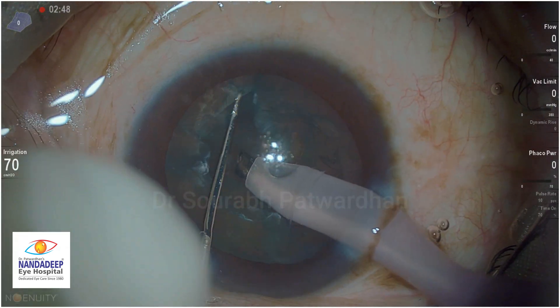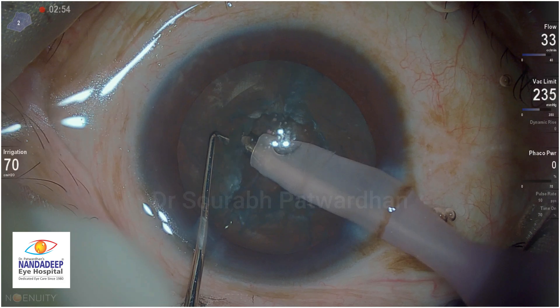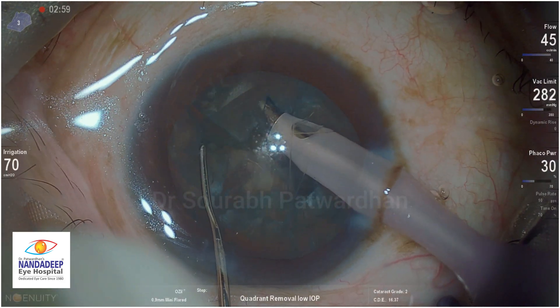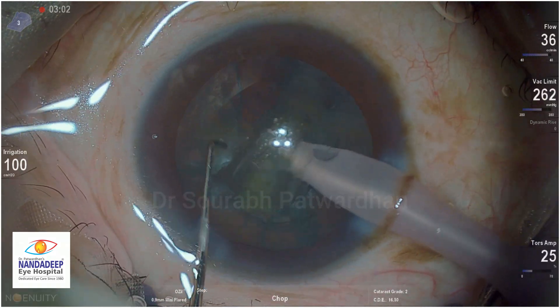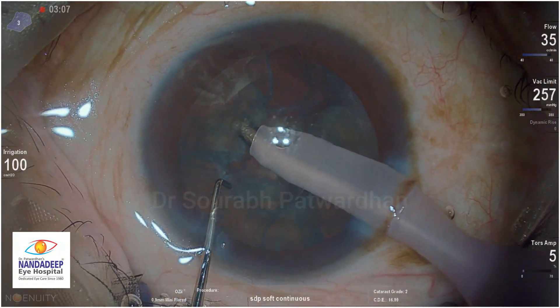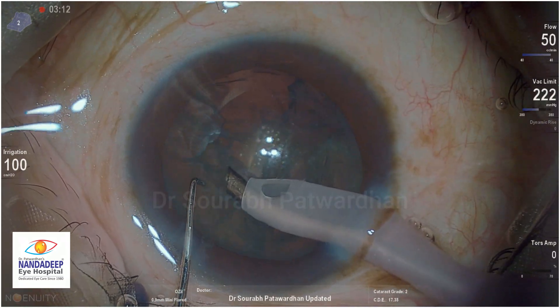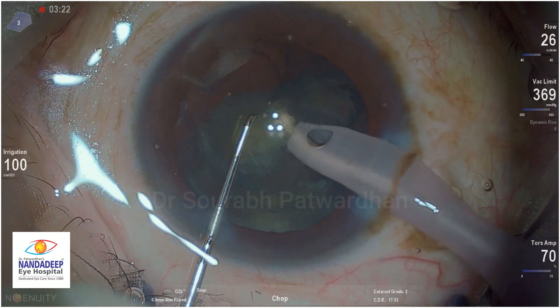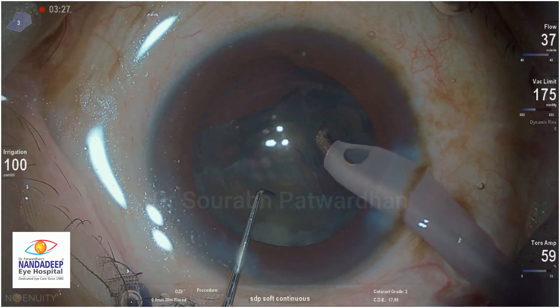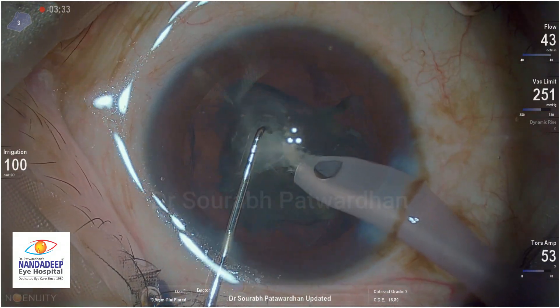If you see on the left side of the screen, the IOP is there. I started with 50cm of water IOP and now for chop I am using 70cm. Instead of venturi mode, I am using the flow mode which is the peristaltic mode of the Constellation. For quadrant removal, I have raised the intraocular pressure to 100 so that I have a very stable chamber. You can reduce the IOP to 60 or 70 but then you have to reduce the vacuum to 200 to 250. I am using 330 vacuum with 40 flow rate, which makes things much faster, and with 100 IOP the anterior chamber remains stable.